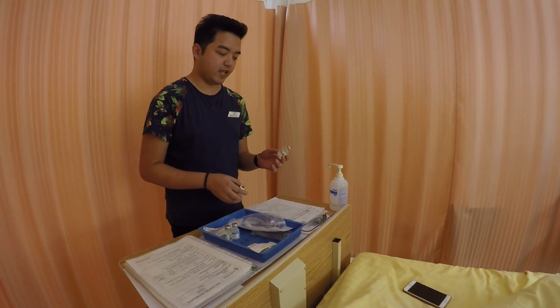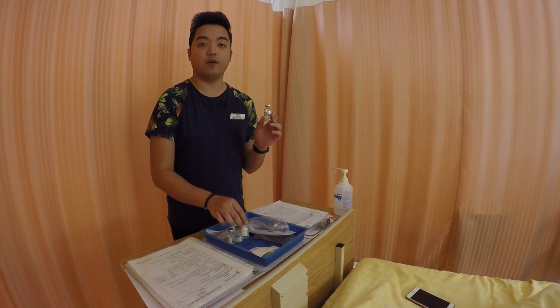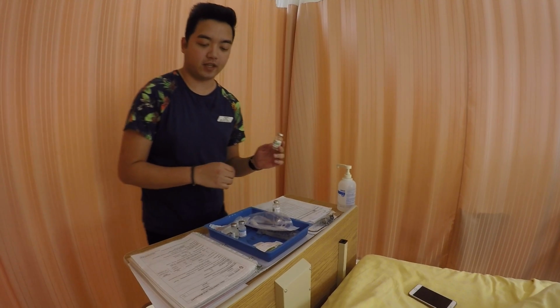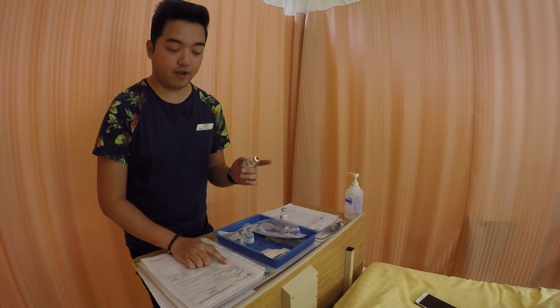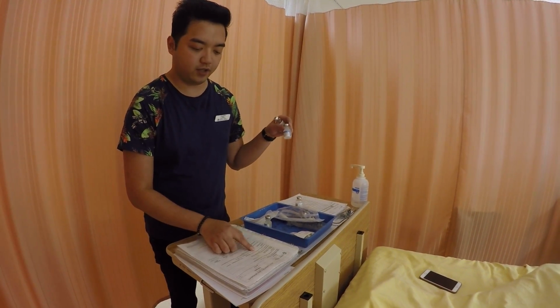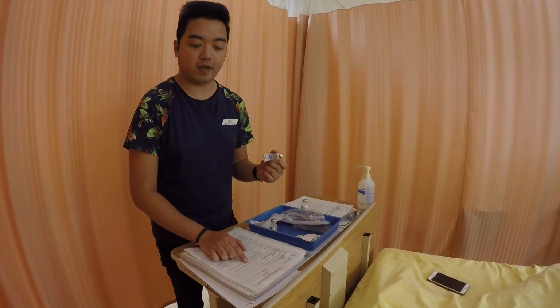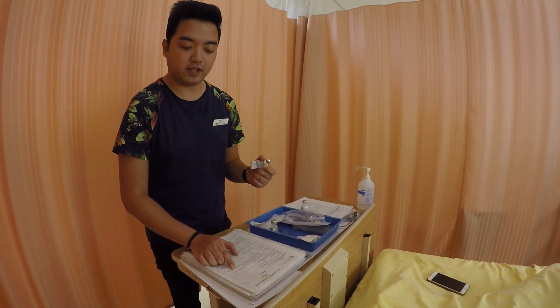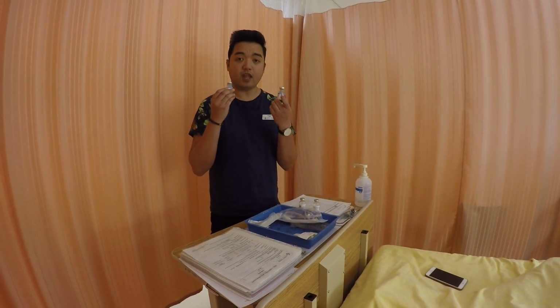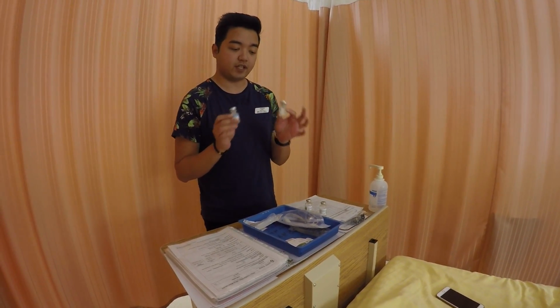First up, cefoxitin comes in a powder form, so I need to check the drug monograph to see how it should be reconstituted. It says here on the drug monograph that for a 1 gram vial, you should add 10 ml of sterile water to get a final volume of 10.5 ml and a final concentration of 95 milligrams per ml. I already have my 2 10 ml sterile water here.